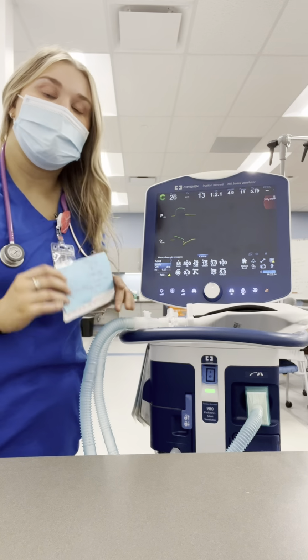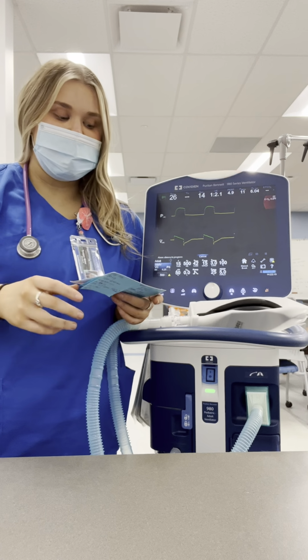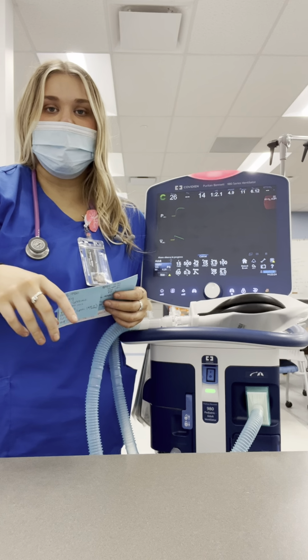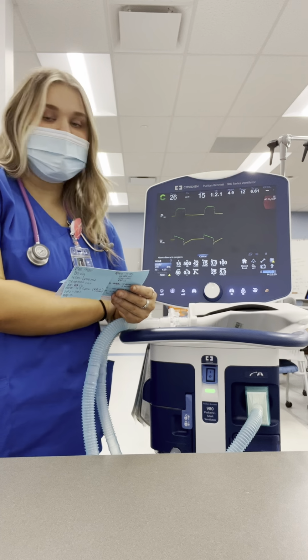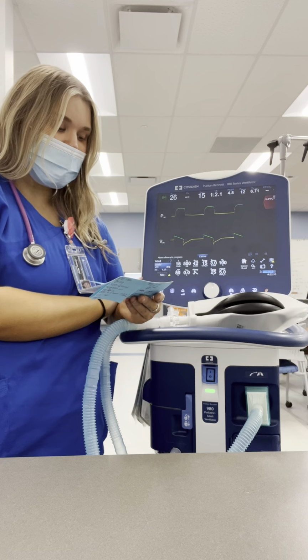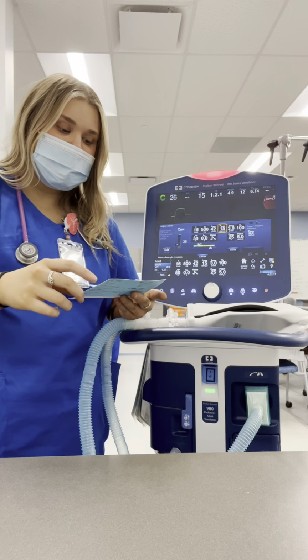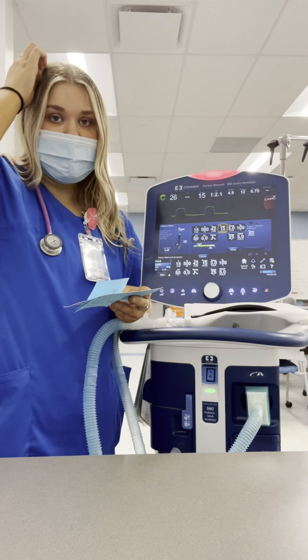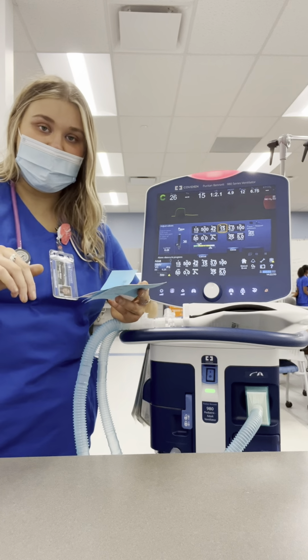Okay, so my patient has been on the mechanical ventilator and they are coming back with a normal ABG and showing signs of spontaneous breaths. So we're going to put them into a spontaneous breathing trial to make sure they are ready to be taken off the ventilator. So we have switched them to an SIMV mode on this ventilator. And we put their pressure support at 15, which is going to be used to augment a spontaneous tidal volume. And we're going to decrease that pressure support in increments of 3 to 6 centimeters of water pressure until it gets to 5.